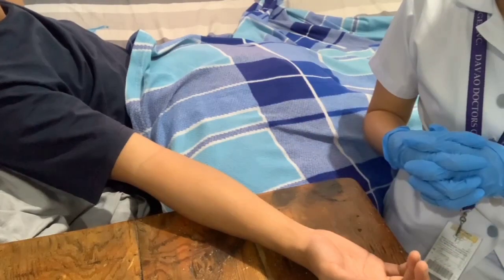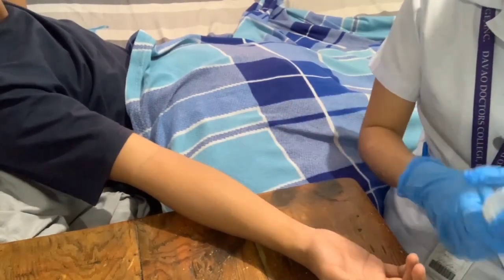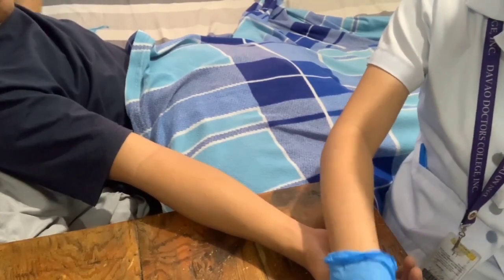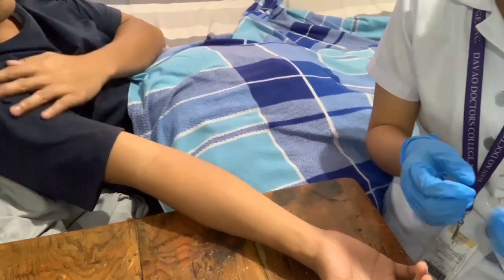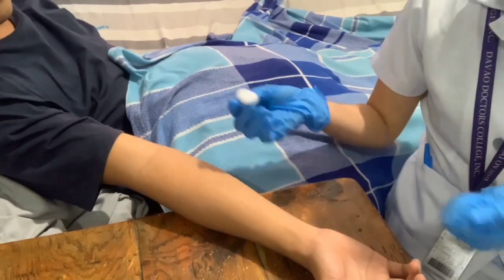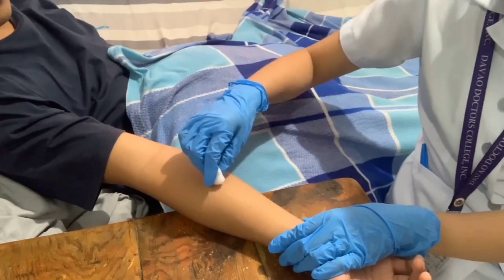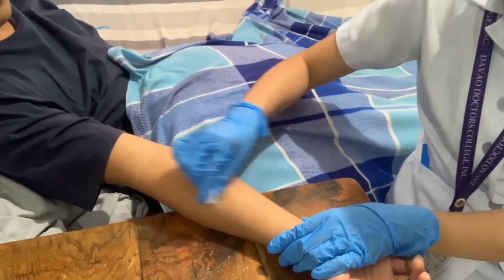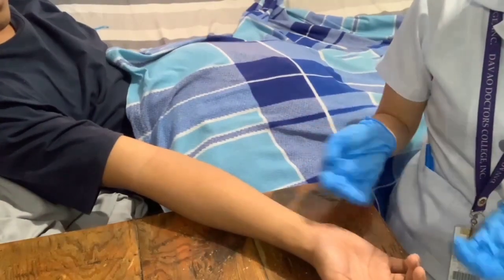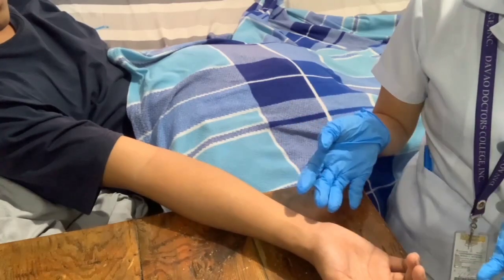Okay, so now we are going to proceed in doing the skin testing. So now we are going to clean the area of the skin that we will be injecting. So you're just going to clean it in a circular motion from the inside to outside. We have to remember that we are going to avoid using the sites that are tender, inflamed, or swollen, or those that have lesions.